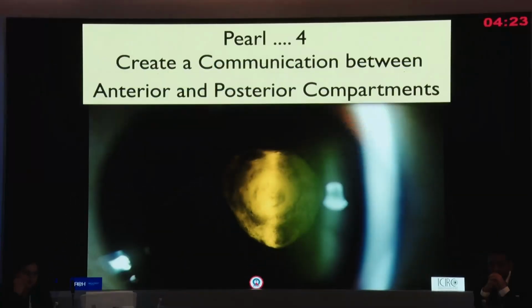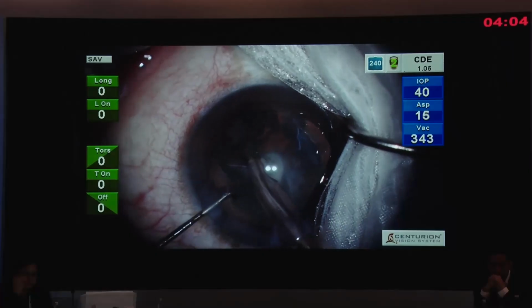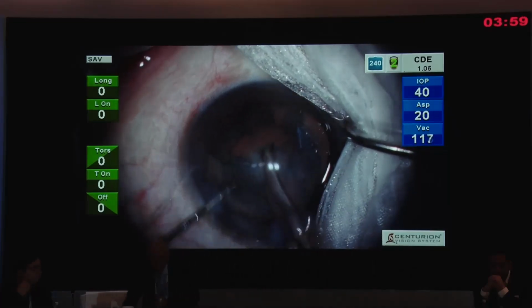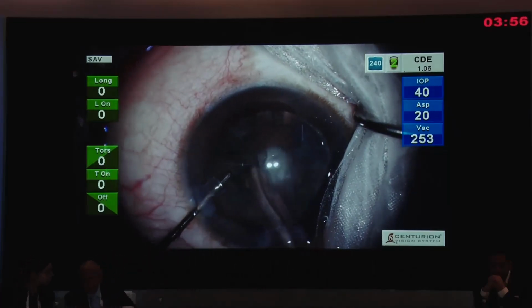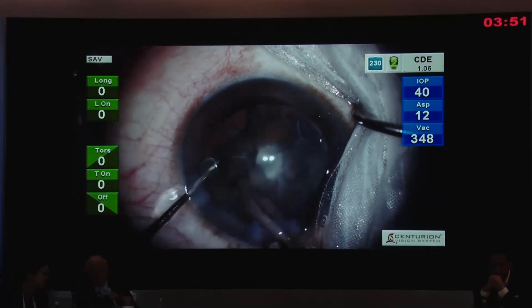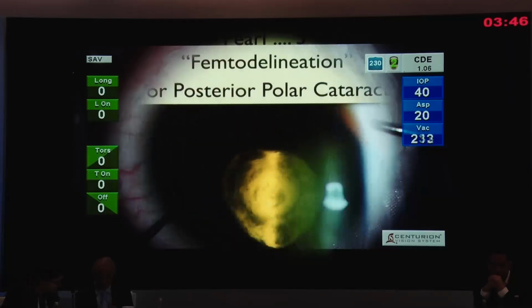Now, this is very important, and we were doing it, and we are doing it, but there was no understanding why we were doing it. What Osher has described is a derouting or whatever, but essentially you are creating a communication between the front of the epinucleus plate and the behind. So you detach the epinucleus only partly, do not bring it to the center, and what has happened is that you're creating a fluid balancing going from the anterior to the posterior, and therefore the risk of the rupture would be reduced.